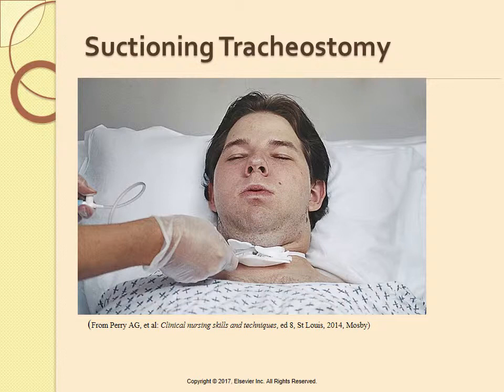Discontinue suctioning if the heart rate decreases from baseline by 20, increases from baseline by 40, if you see a dysrhythmia, or if your SpO2 level decreases to less than 90%. After each suction pass, oxygenate for at least 30 seconds with 5 to 6 breaths by ventilator, MRB, or deep breaths with oxygen.